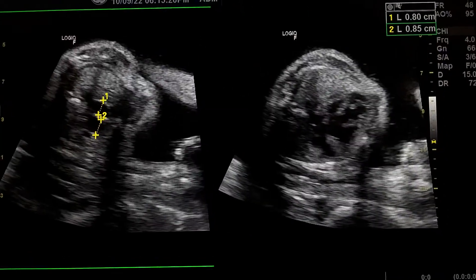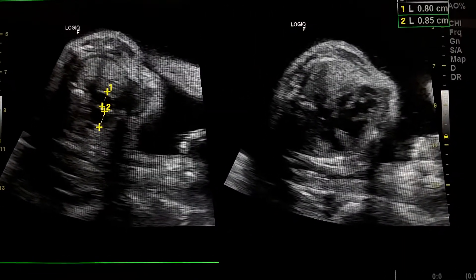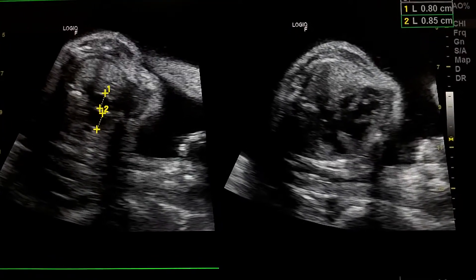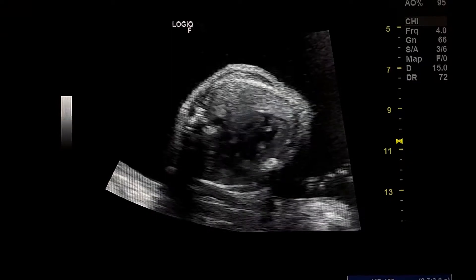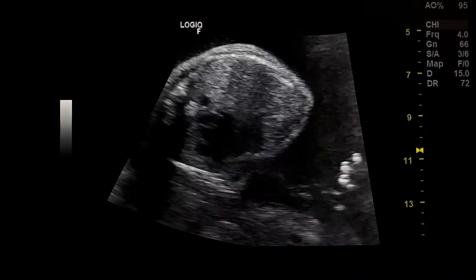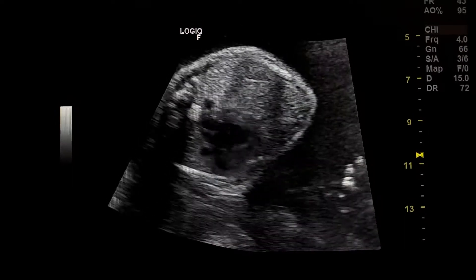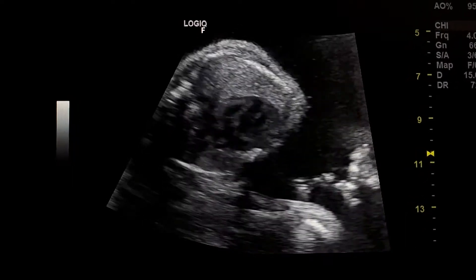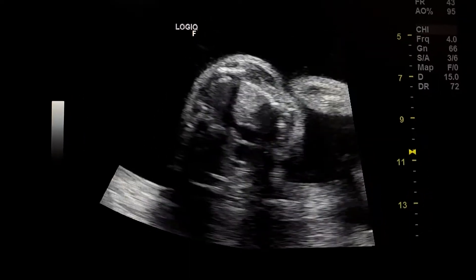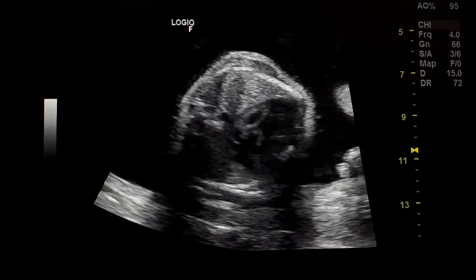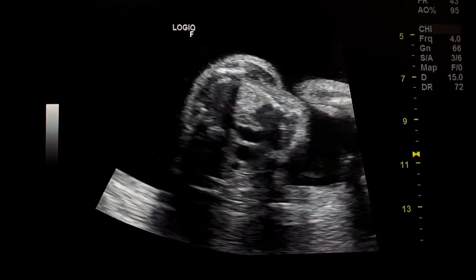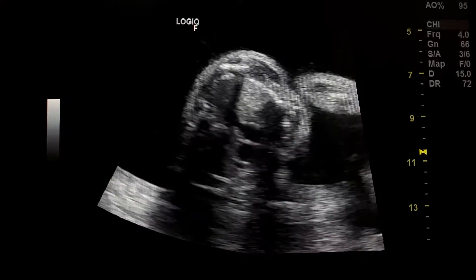Here we see the great arteries arise parallel to each other. We have one atrioventricular valve. Here we see the great arteries arise nearly from the same ventricle.